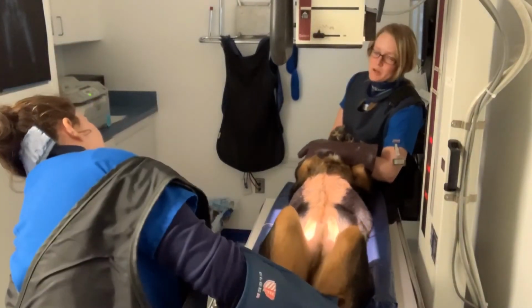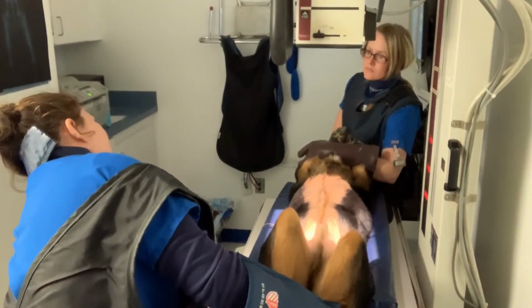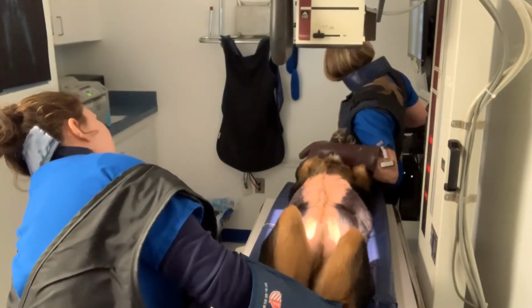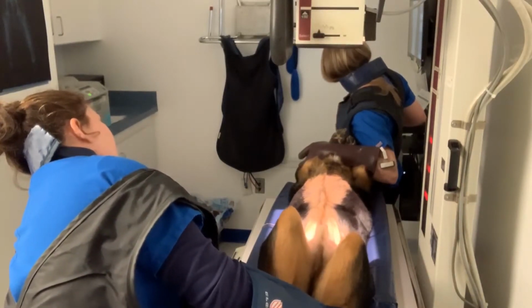Prior use of tranquilizing or other drugs affects the transit time. If tranquilization is required in morphological studies, consider acepromazine for dogs and ketamine for cats.